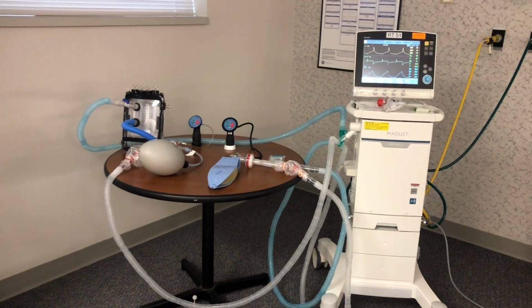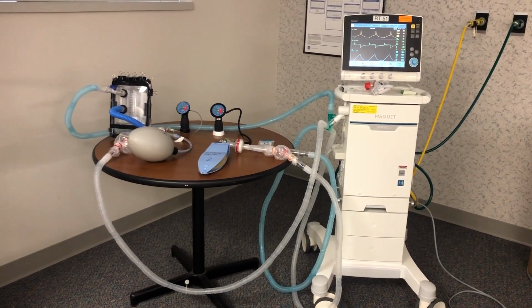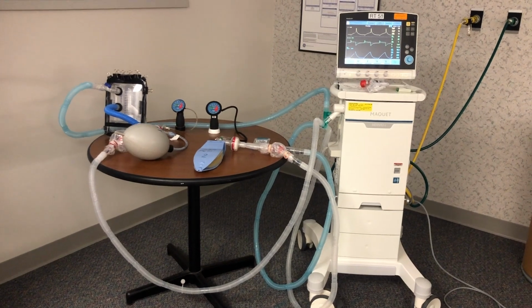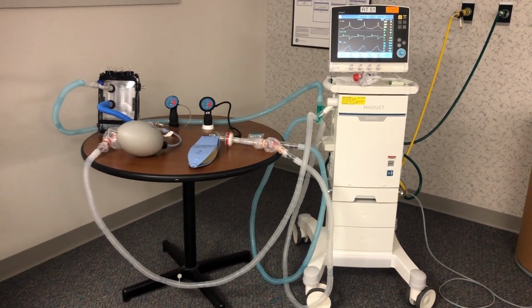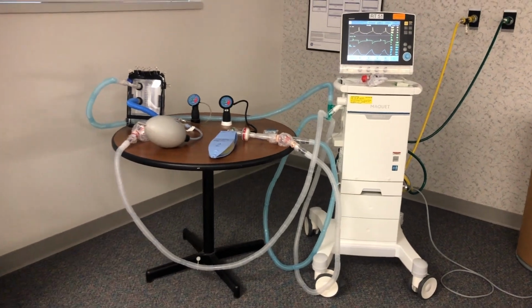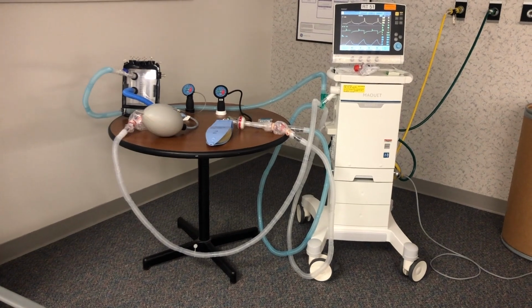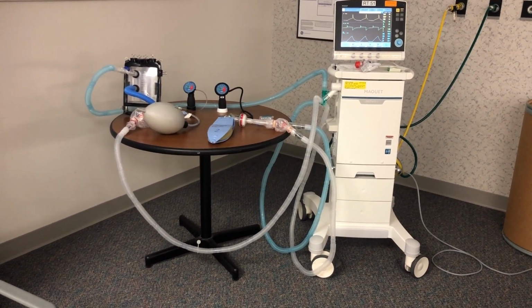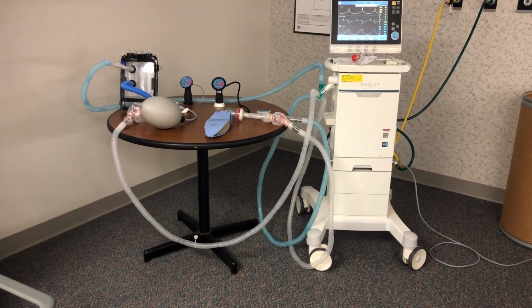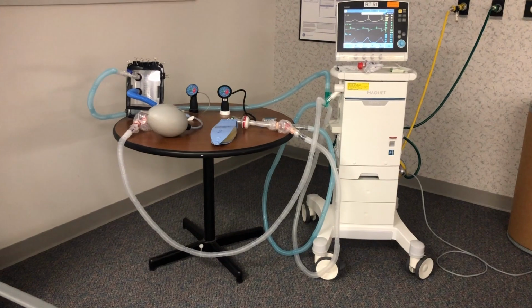Again, please feel free to ask me any questions, any concerns about this setup, and I'll put that in the documentation too and in a diagram, so we can probably help save some patients who should not die because of lack of ventilators. Thank you very much, and just a few comments here.